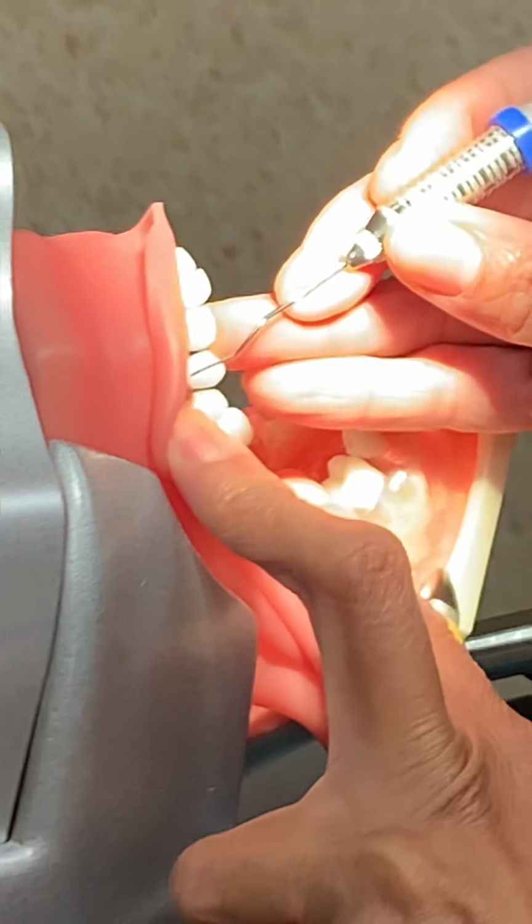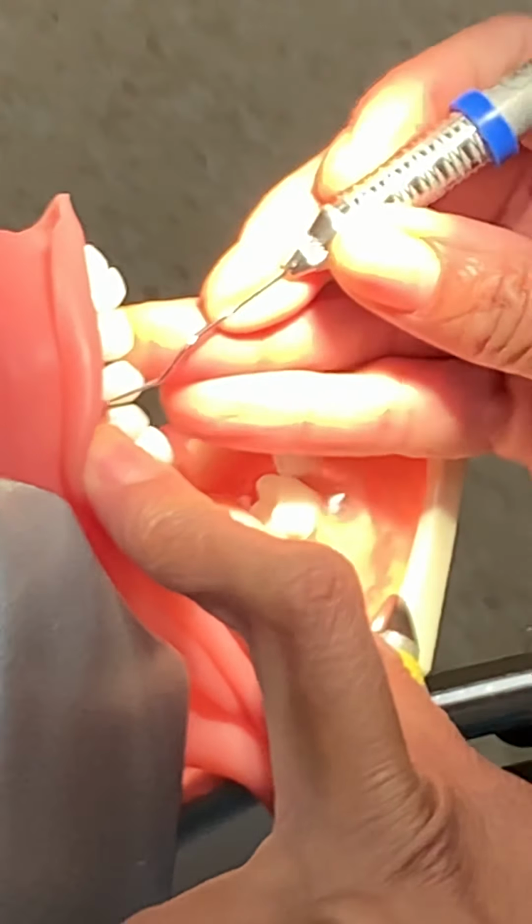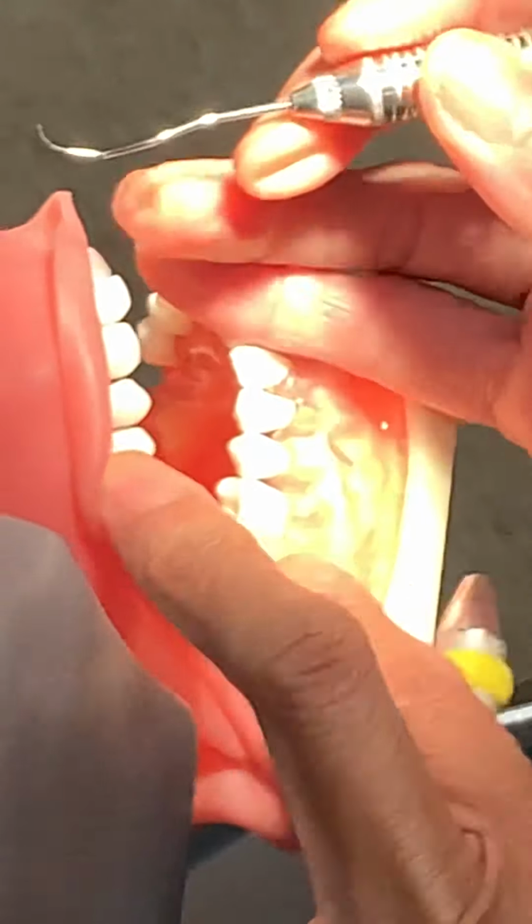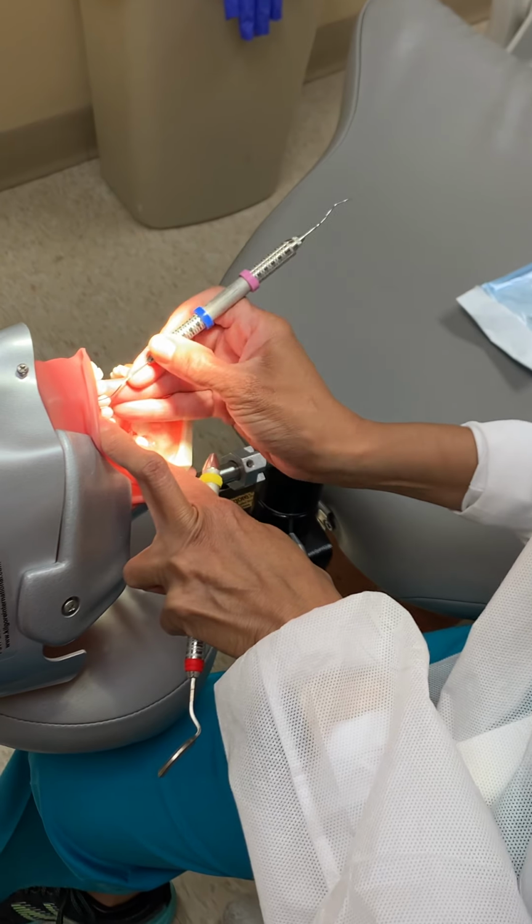Distal line angle, going distal. And see, once again, we talked about it earlier on. My wrist is up because I'm on the maxillary. Distal line angle, coming all the way in proximal to the mesial.